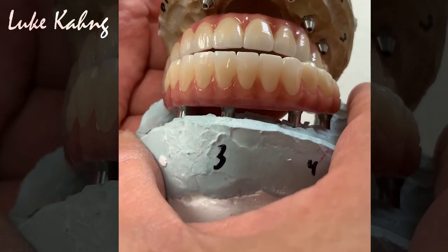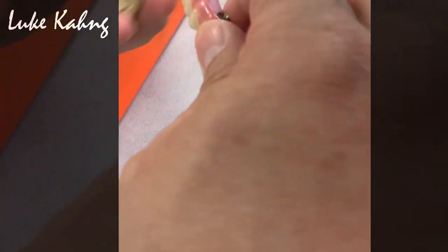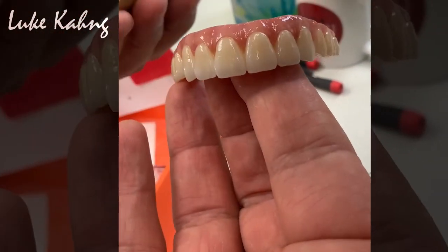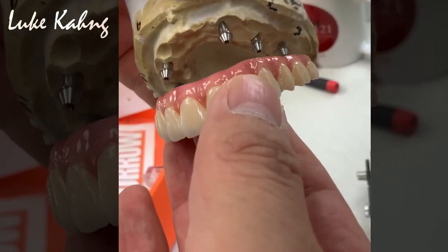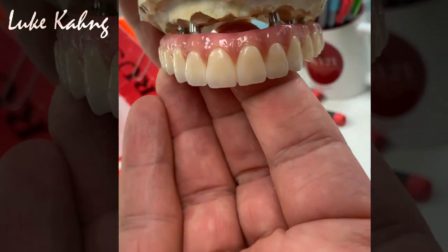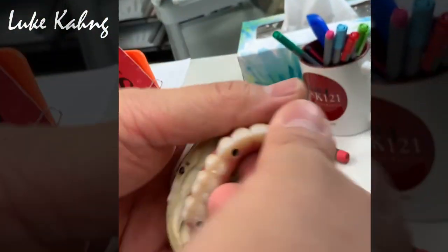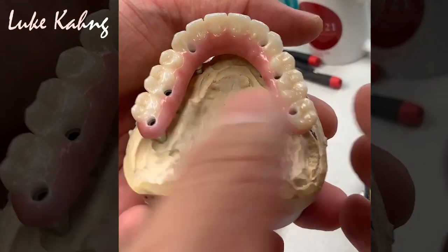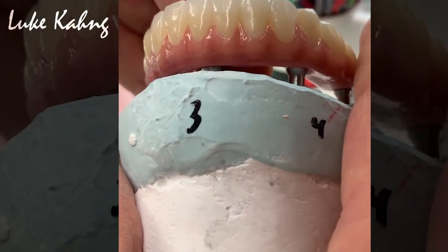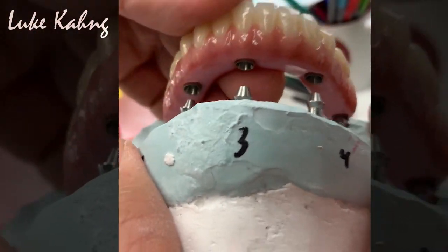Alright, this is a beautiful double arch case. We cement it with the ti base. So I finish. This is a 6 implant case. Let's make sure the whole fitting is good. And then here is his aesthetics. I spent a lot of time. This is monolithic, and the lower, same case. It's great. Great piece of art.